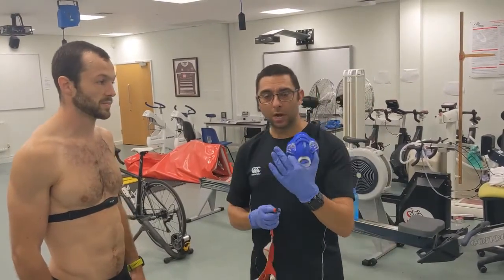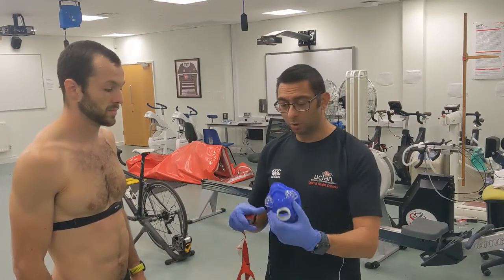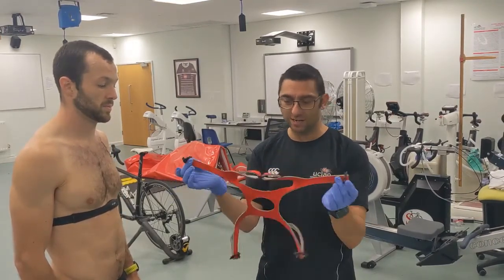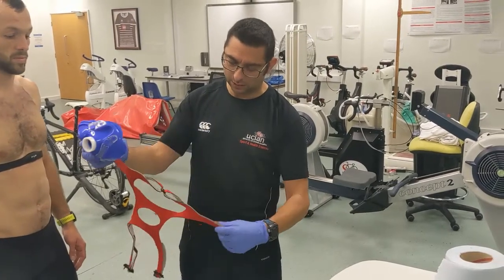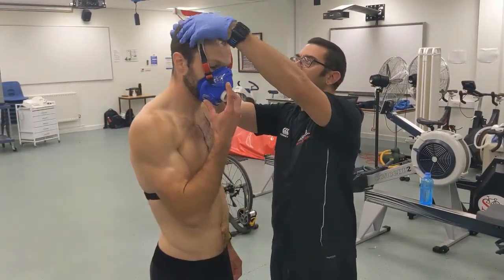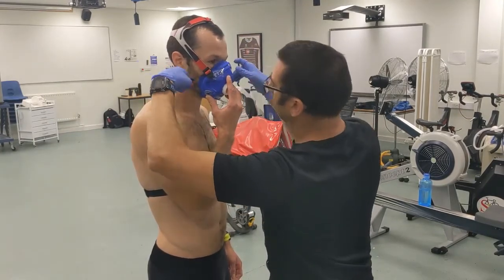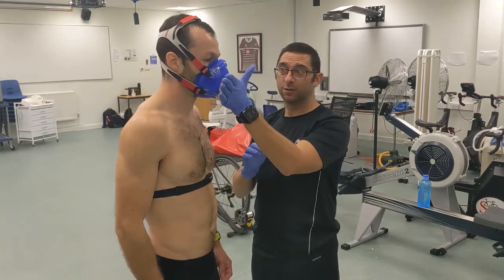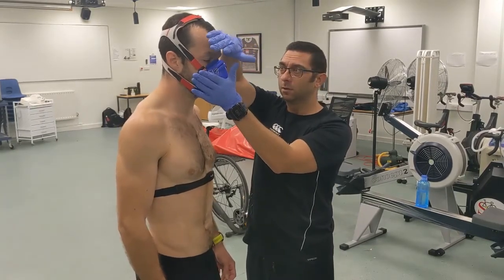Once the Metalyzer is set up and warmed up, you need to fit the mask. There are different sizes printed on the bottom. You want one that's a good fit but not too tight. Take the cradle — the skull cap goes red side in, broad side at the top, and narrow straps at the bottom — and hook those into the little clips. Put it over the top and click the bottom straps on. It needs to be a good seal but not so tight it crushes the face. Put your hand over the end and ask the participant to breathe out — if you feel air escaping, it needs to be tightened.